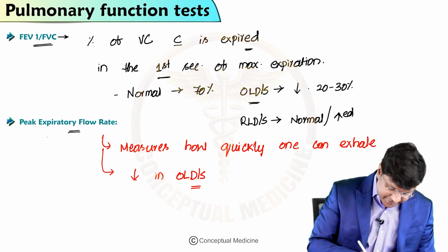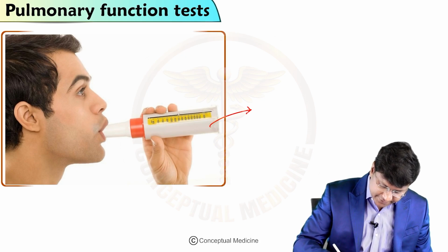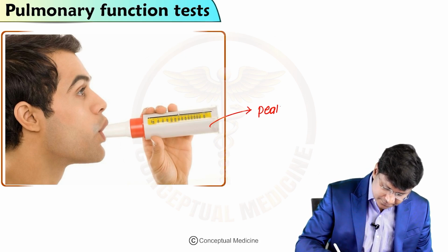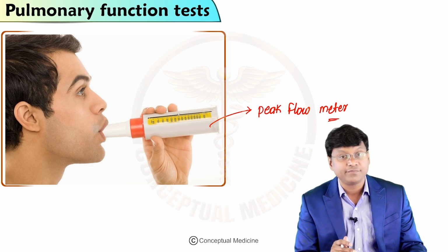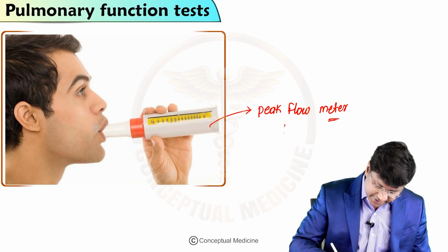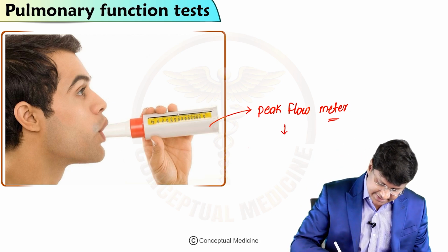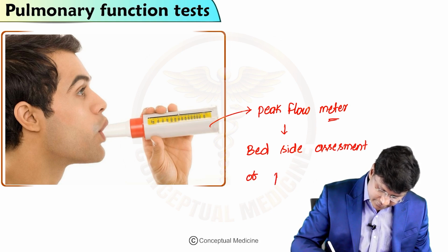It is measured with the help of the peak flow meter. Now, this peak flow meter is used as a bedside assessment of pulmonary functions.